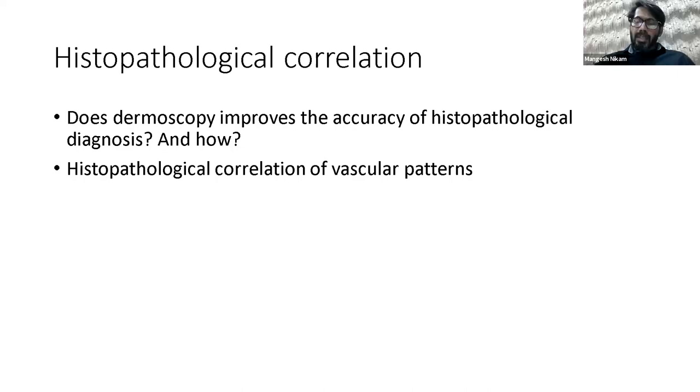Dr. Nikam? See, except the larger tumors like hemangioma, or capillary malformation like port wine stain, or angiokeratoma or lymphangioma circumscriptum, I don't think the smaller vessels are that visible as you see in dermoscopy. Dermoscopy has that liberty, that vision of showing all the linearly traversing vessels which are in arborizing pattern or linear pattern or different circular patterns, glomerular pattern. So many patterns are visible on dermoscopy, and that's an advantage of dermoscopy, which is absolutely not seen in the vertical orientation of the histopathology, where they are cut vertically in only one dimension, as in a dot or as in a circle or as in tortuous material. So if you take the tumors, yes, it might get correlated, like angiokeratoma as mentioned earlier, but for these arborizing vessels, tortuous vessels, glomerular vessels, this is not at all correlated on the histopathology because the orientation is different. It's a totally 90 degree orientation of the two scopies.